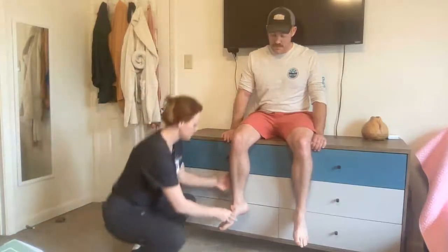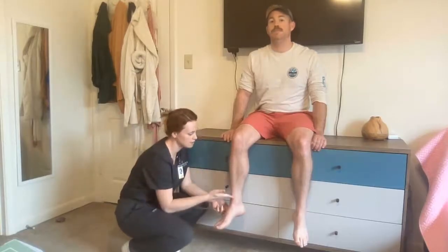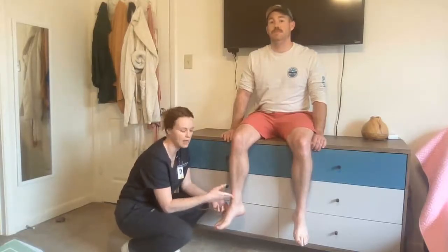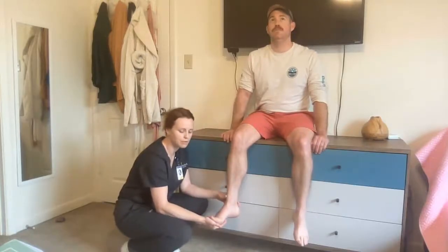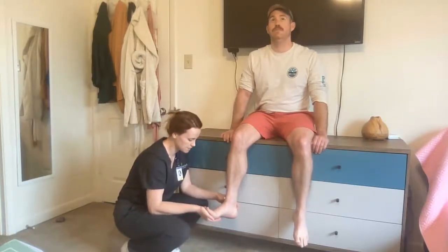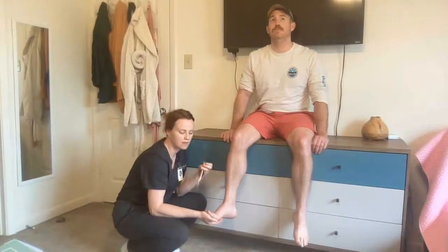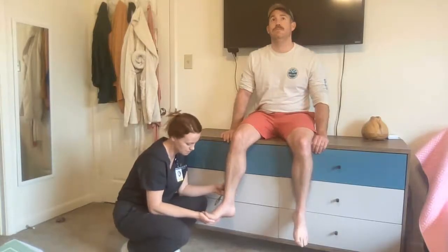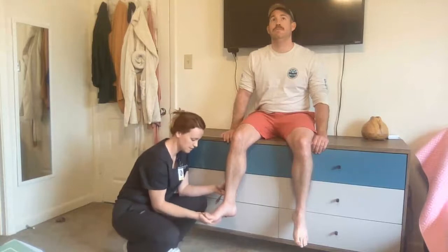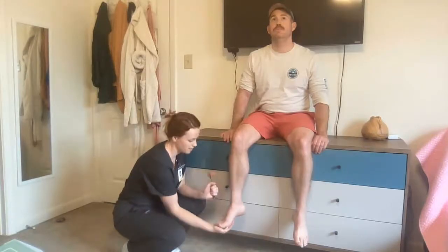For the Achilles tendon, same thing — the leg needs to be dangling and completely relaxed. I'm going to put my hand underneath the top part of their foot, dorsiflex the foot just slightly, come back, locate the Achilles tendon, and tap on it with the wide side of the hammer. To notice the response, the foot will plantar flex, meaning it will slightly go down. So I'm going to tap on the back.